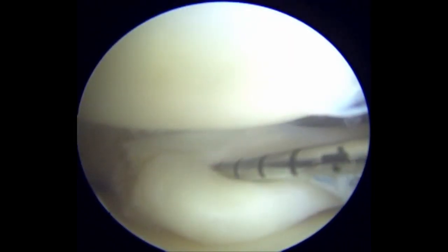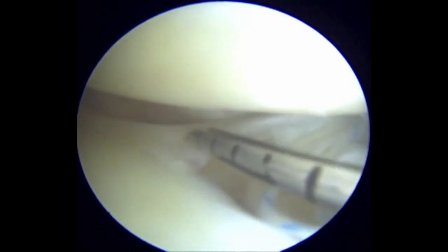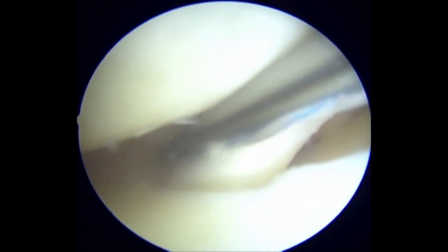Using an all-inside meniscus repair device, the first side-to-side stitch is placed at the most peripheral aspect of the tear, in the red-red zone of the meniscus. This stitch is placed perpendicular to the tear and helps to reduce the tear gap.